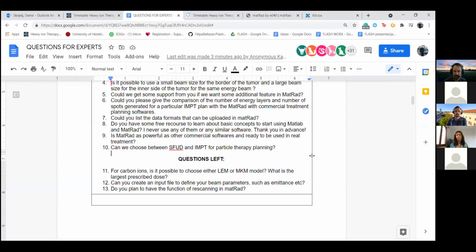So at the moment, in principle, the functionality is there. So you just need the model. You just need to implement the model. If you implement the model, you can calculate and directly use the optimization capabilities. It has the infrastructure for using different models. For example, on our research branch, you are also able to choose different proton models. And they will always work with the same optimization technique that Hans-Peter will explain on Thursday, right? Yes. So that would be a primary example.